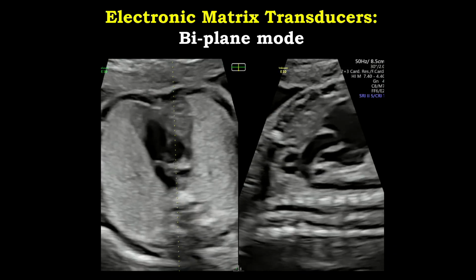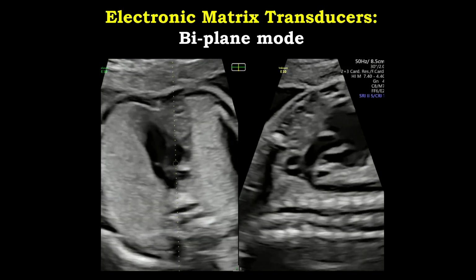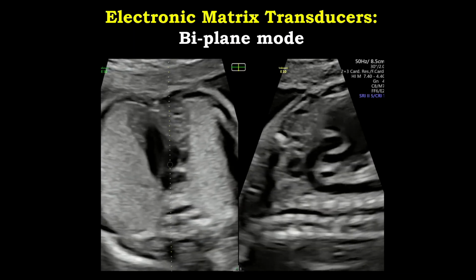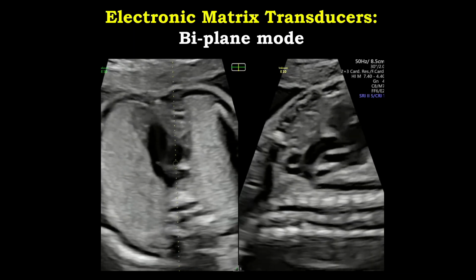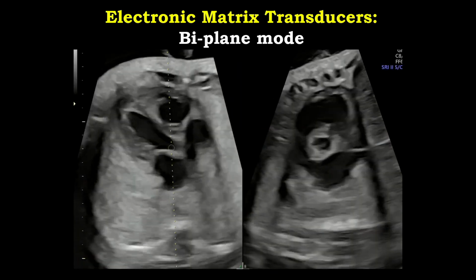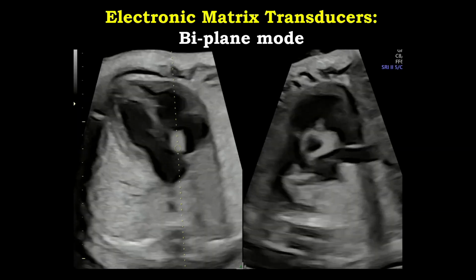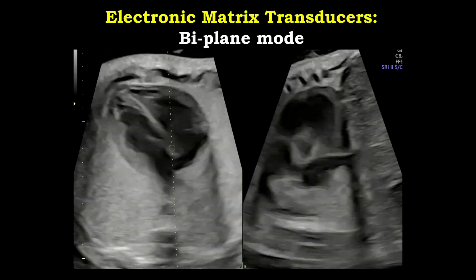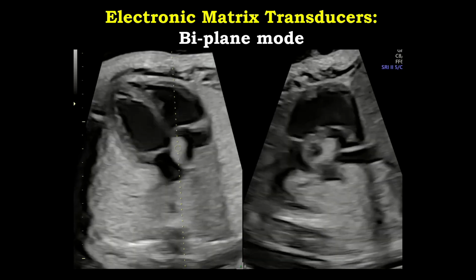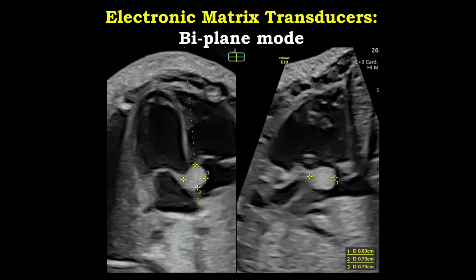The other application that is available on specific probes, such as the matrix electronic probes, is biplanar mode. Here you can see that we can use the advantage of looking at the 2 orthogonal planes simultaneously. That can be useful when you're assessing some masses within the heart, and you can simultaneously look at the 2 planes, like sagittal and axial, in order to better describe where that lesion is located. That can be used for measurement.